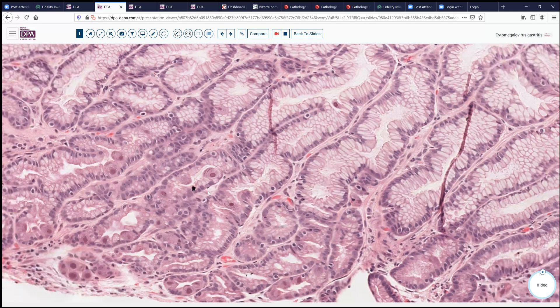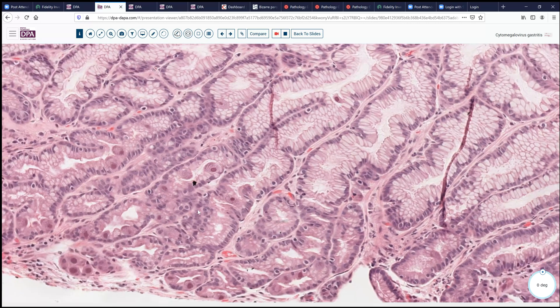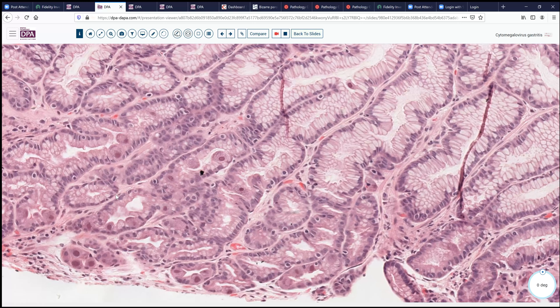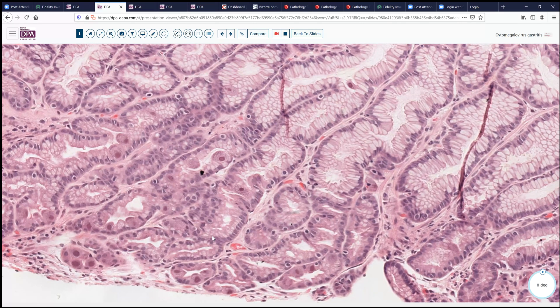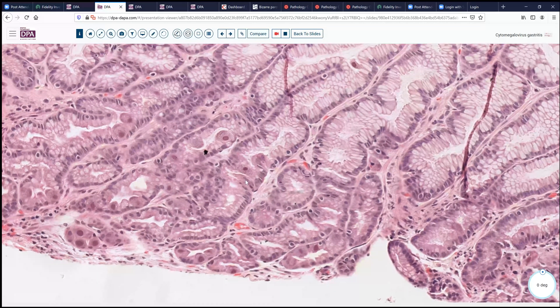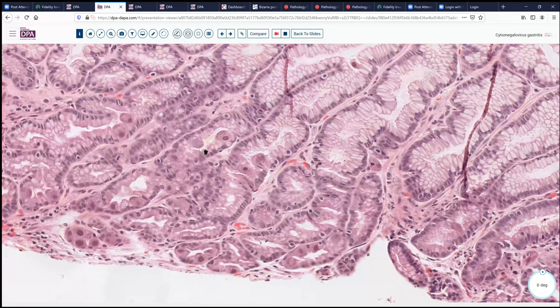And sure enough, what we're seeing here are very striking eosinophilic nuclear inclusions in these enlarged cells. In addition, you can see very nicely here a granular sort of purplish cytoplasmic inclusion.